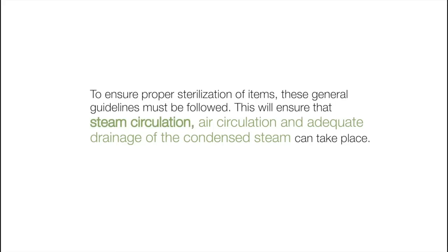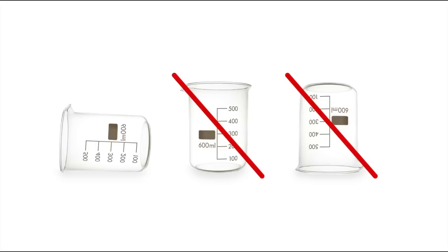This will ensure that steam circulation, air circulation and adequate drainage of the condensed steam can take place. All containers must be placed so the opening allows steam to enter and the air and condensate to drain from the container.